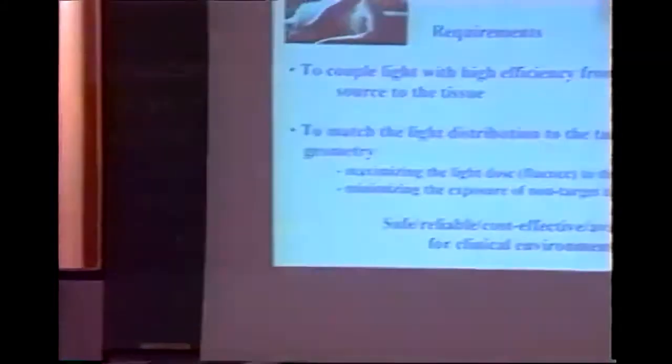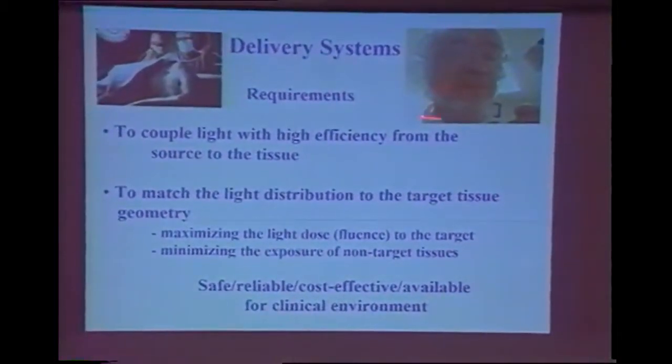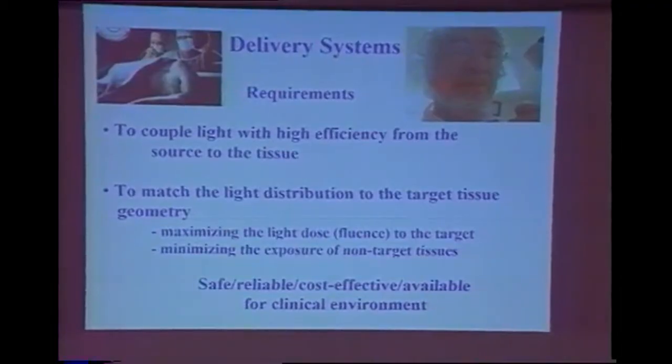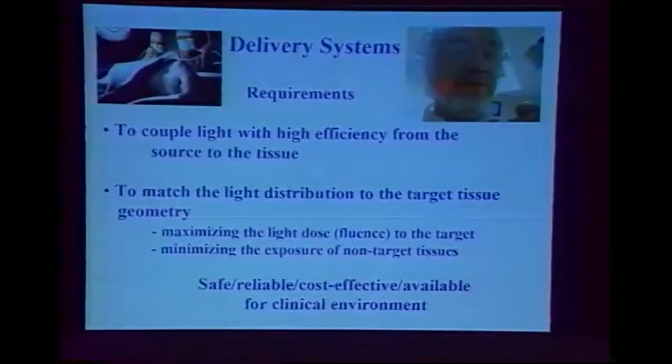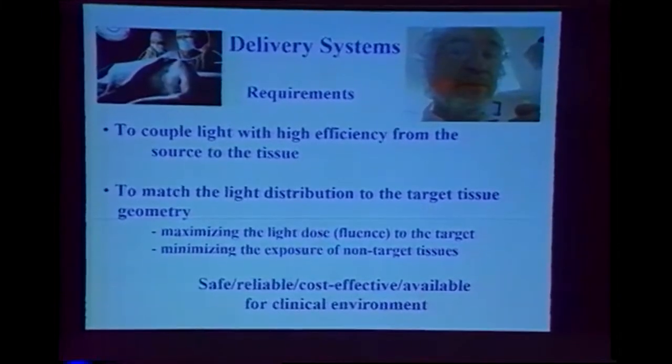Delivery systems. So this is Paul Mueller, who's a neurosurgeon that we work with, fooling around, showing that you can use an optical fiber to deliver light. Nice slide. You can deliver light into optical fiber. And he is one of our volunteers receiving optical fiber treatment.